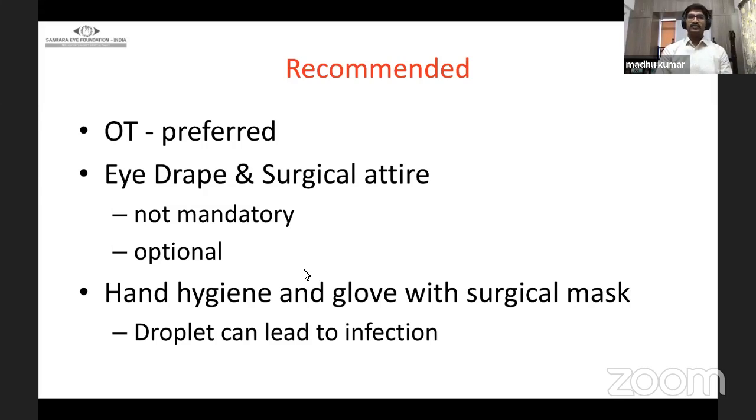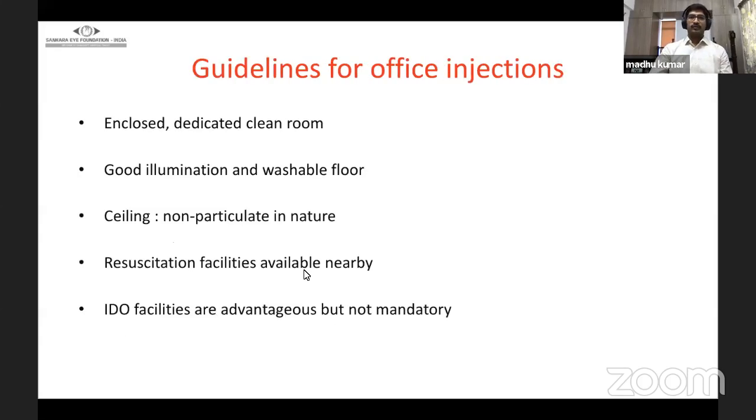The surgeon needs to wear the glove and surgical mask after a good hand scrub, and can then administer the injection. So you need not wear an OT gown. So if someone wants to practice the guidelines and give injections in their OPD or minor OT, this is what needs to be done.